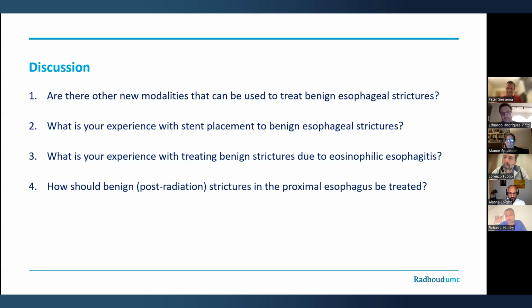Yeah. So once you can start and you can get them up to a bougie of 12 to 15, you can then send them home with a 42 or a 45 French self-dilator, and it's tolerated very well, and the side effect profile is low, and the quality of life outcomes afterwards are incredibly pleasing to see. So how do you teach patients to self-dilate? Is there a special team for that, or how do you manage that?